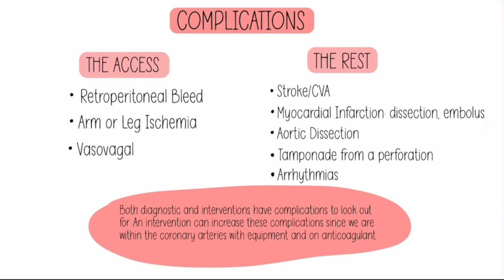Now, what are some of the complications that can happen during this procedure? And again, I don't mean to scare anyone, but if you are working in the cath lab, you really need to know every worst case scenario that could possibly happen, because a lot of these things are preventable if you pick it up early. If you know what that's leading to, you can intervene really early and prevent it from becoming an event that's difficult to come back from.